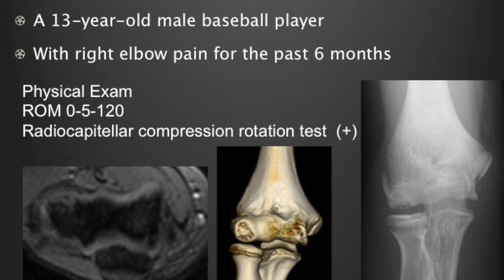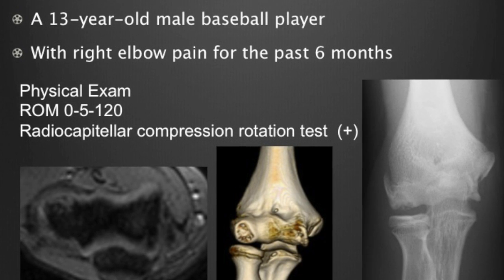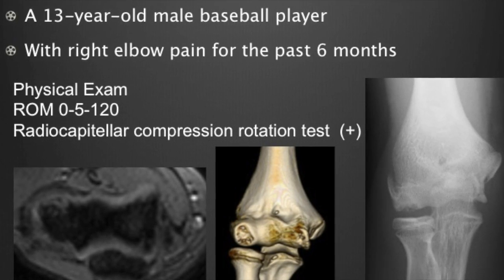This movie shows an arthroscopic technique of fragment fixation using HAPLA thread pins.